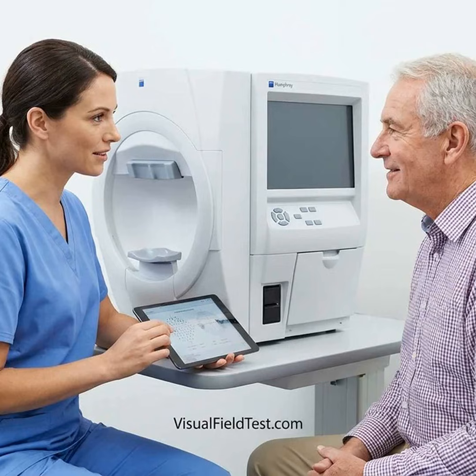Tell the clinic if you are worried about the test. Anxiety is common and can be addressed before testing. Ask whether a video or practice demonstration is available. Fatigue, alcohol, central nervous system suppressing medicines, physical limitations, uncorrected refractive error, and eyelid problems can all affect visual field performance.